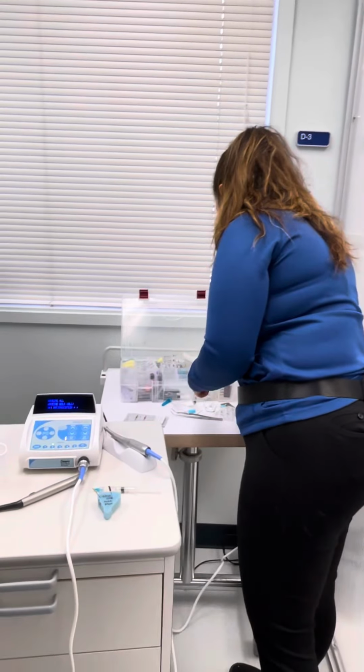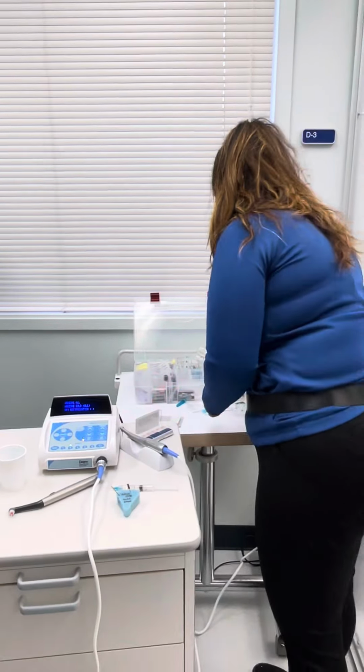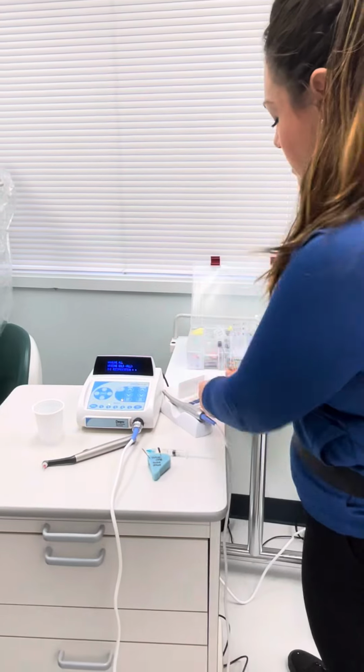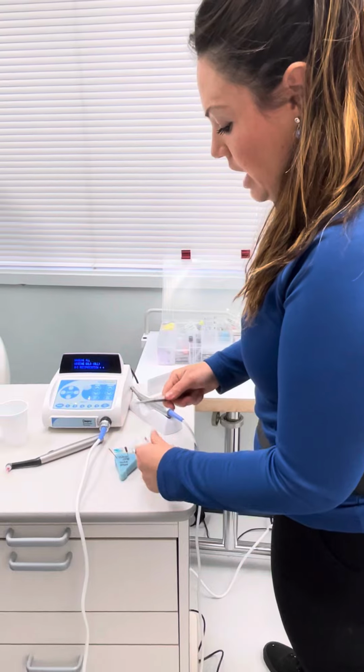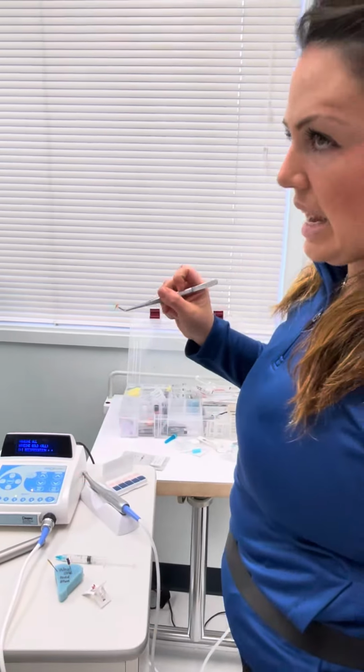And then you're drying with your paper points. We can do it for the sake of the demo. Again, I think we should preload this, but otherwise this is how it comes. Same thing. Not every paper point's the exact same.